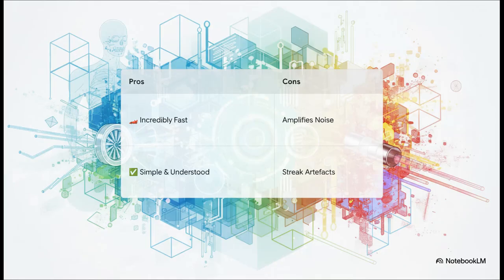And for decades, this method, FBP, was the absolute king. Its biggest pro: speed. It was incredibly fast and pretty easy on the computers of the time, which was huge. But it wasn't perfect. The big trade-off is that the same sharpening filter that gets rid of the blur also makes any random noise in the data way worse, so you can end up with grainy images. And it really struggles with things like metal implants, which create these big, ugly streaks across the picture.